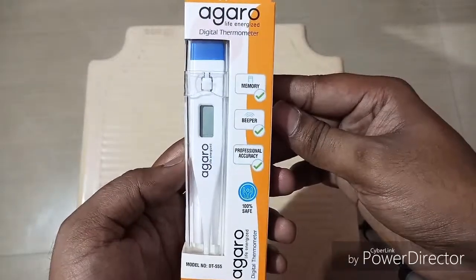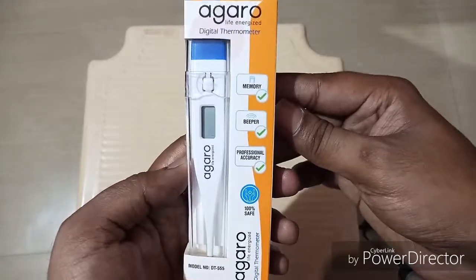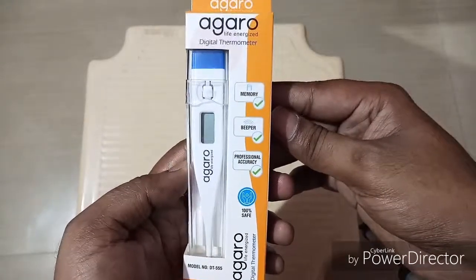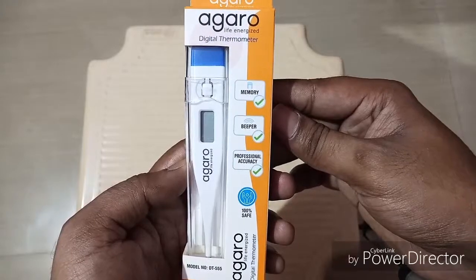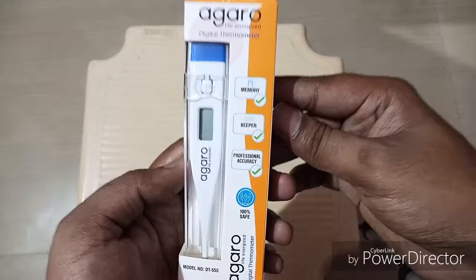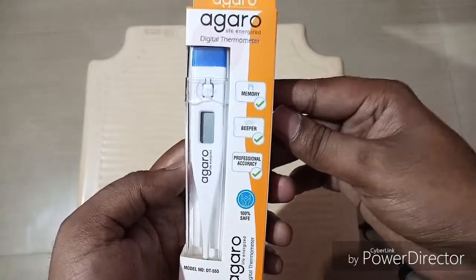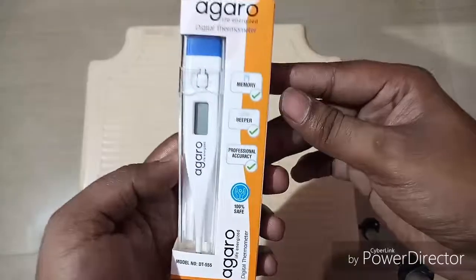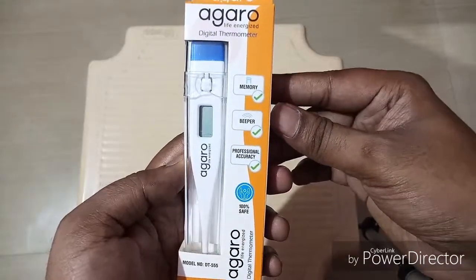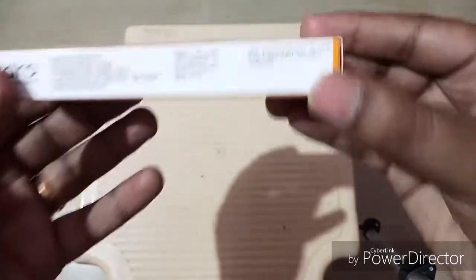We use a thermometer to find the temperature in our body, especially if we have a fever. Digital thermometers are very good because they are so easy to use — they show digitally how much the temperature is. They are also very cheap nowadays, available at all medical shops. The price of this thermometer is just 155 rupees.